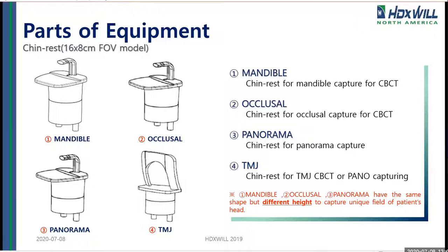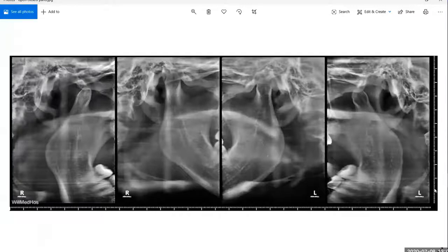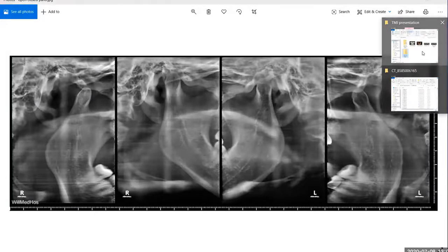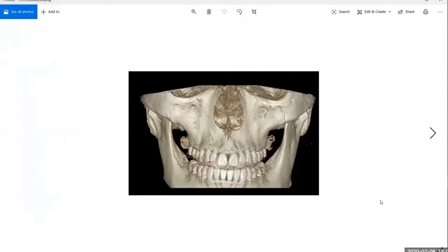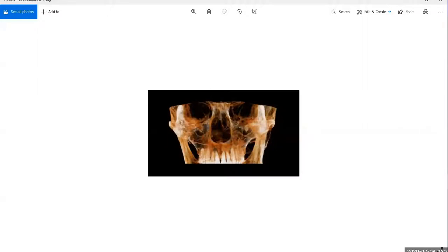This can be done for Pano and also for CBCT capturing in the 16x8. To give you a visual example: here you can see a CBCT with that positioner, where now we're getting a much higher view of the whole TMJ by using the 16x8 with the TMJ positioner. This x-ray view shows how we can move the patient down and get that with a 16x8.